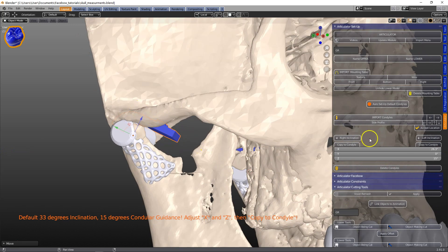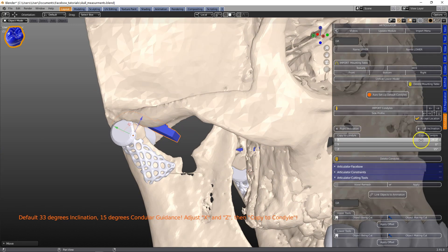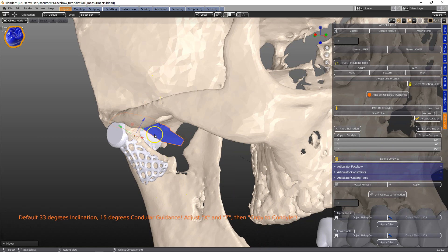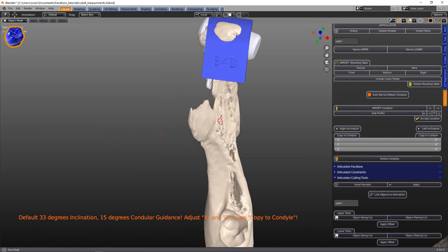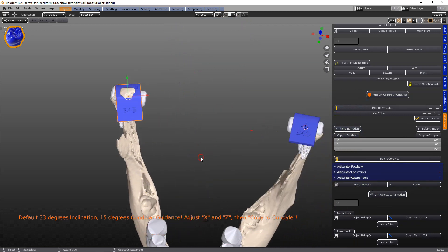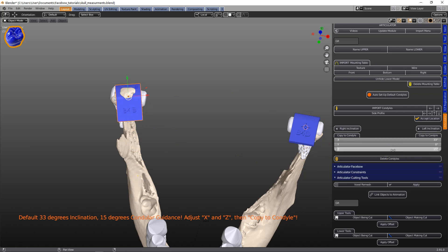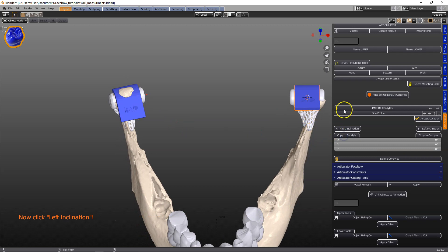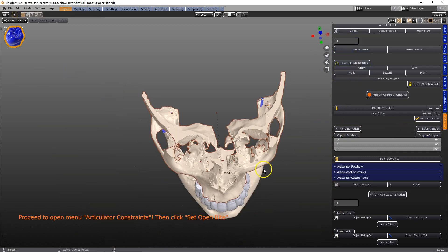If you know the value, put the value in. If you don't, leave it at the default 33 degrees. Then we can set the other angle as well — the 15 degrees default is pretty dead on. If you look at the long axis you can change this; I'm not sure how this would affect small kids, for example. But we're going to keep the 15 degrees.